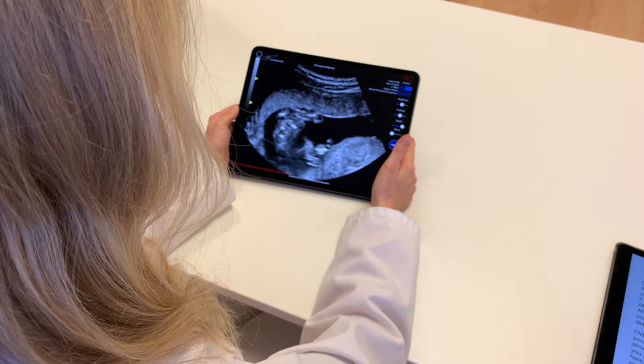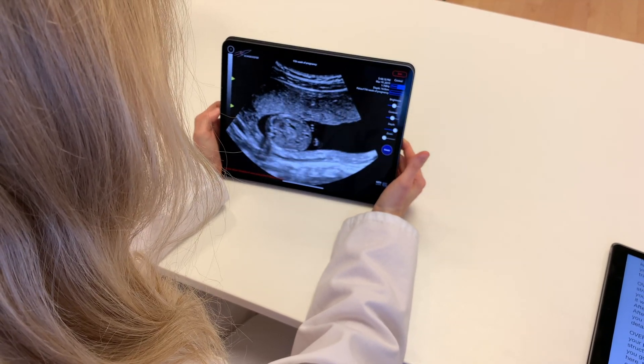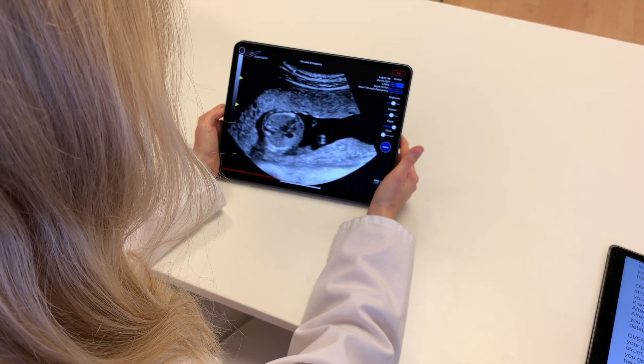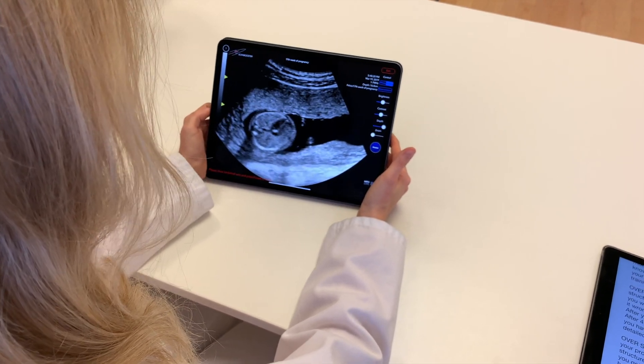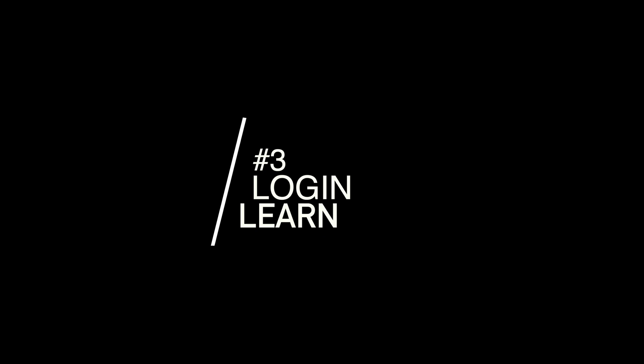Congratulations! You are now fully set up to log in to ScanBooster Ultrasound Simulator and ScanBooster Control Pro. Step 3: Log in and learn.